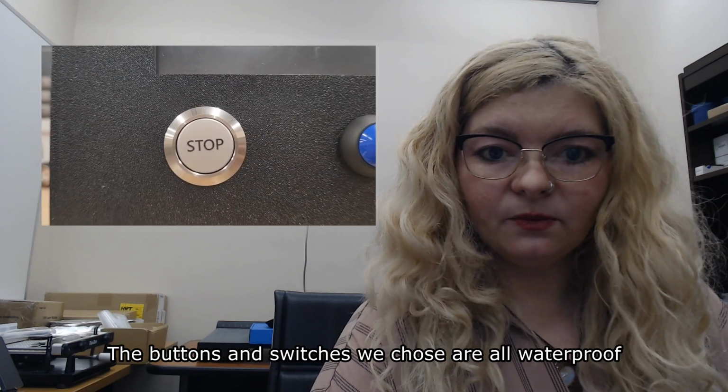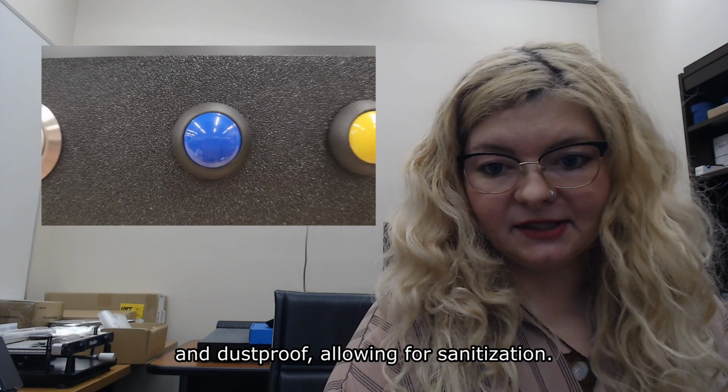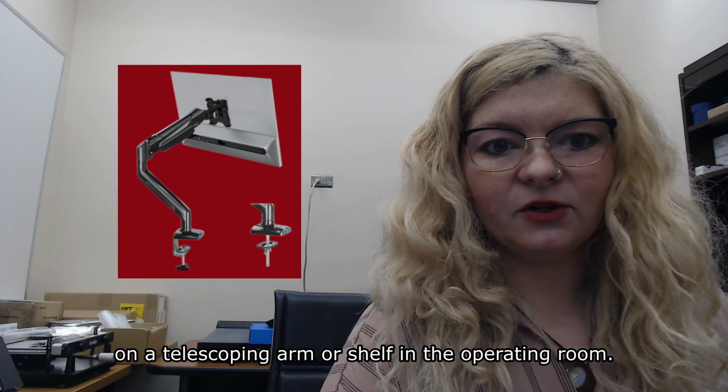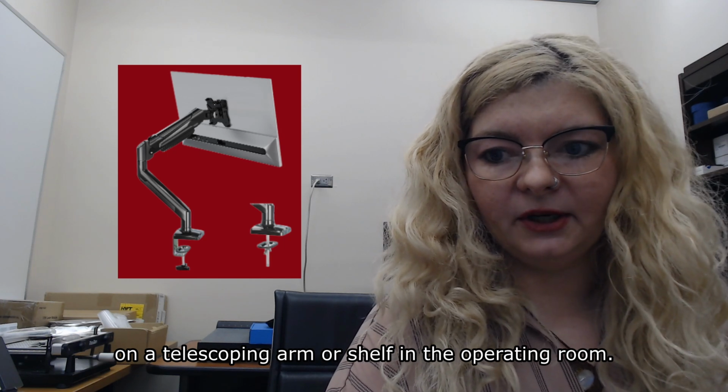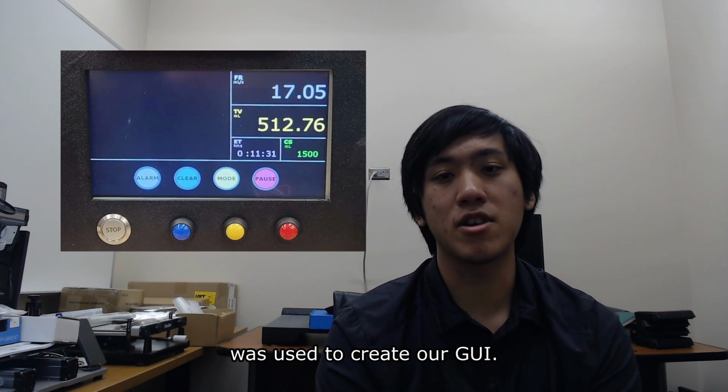The buttons and switches we chose are all waterproof and dustproof, allowing for sanitization. We upgraded the monitor case so that it can be mounted on a telescoping arm or shelf in the operating room. The Nextion editor, which is a development software, was used to create a GUI.